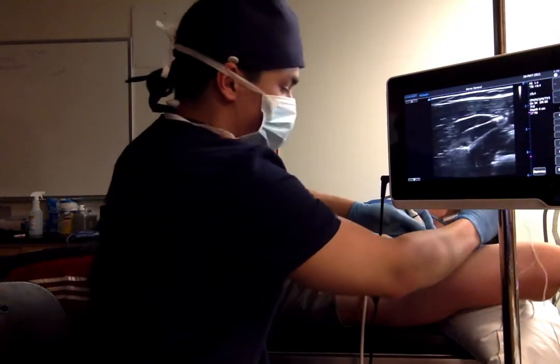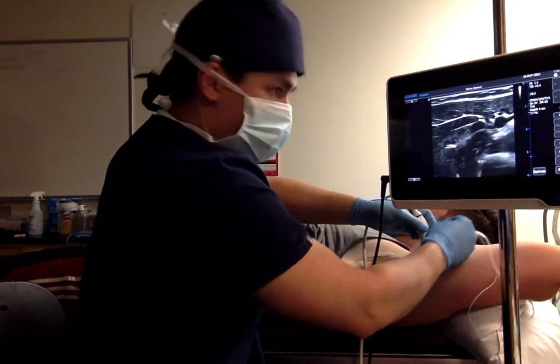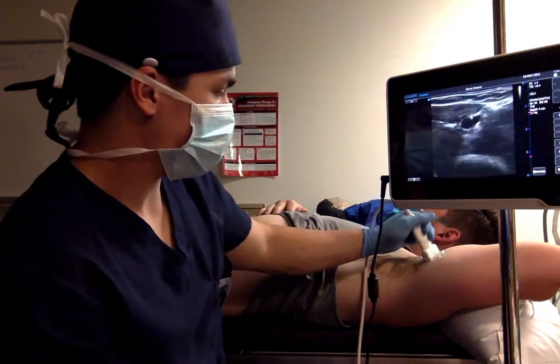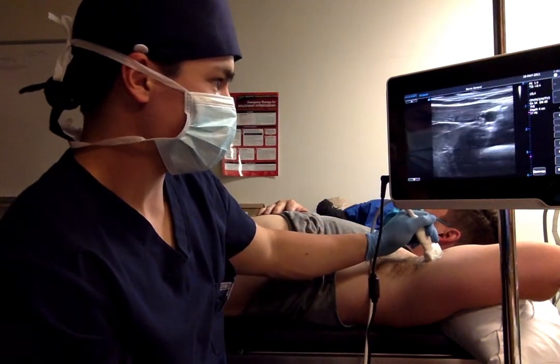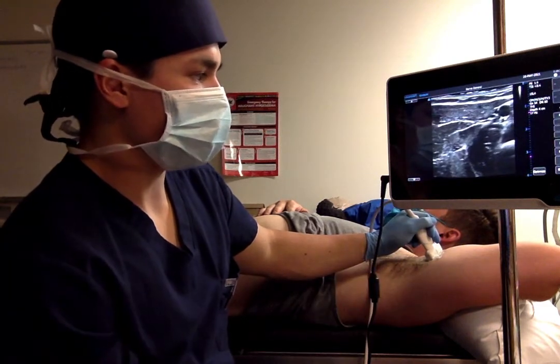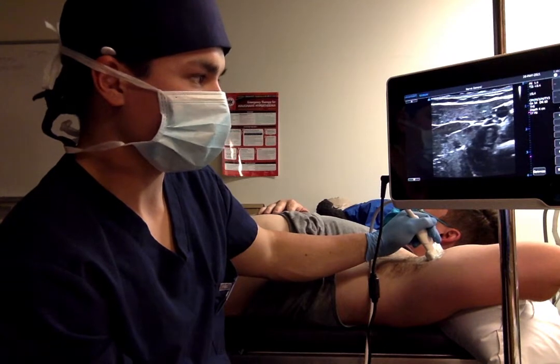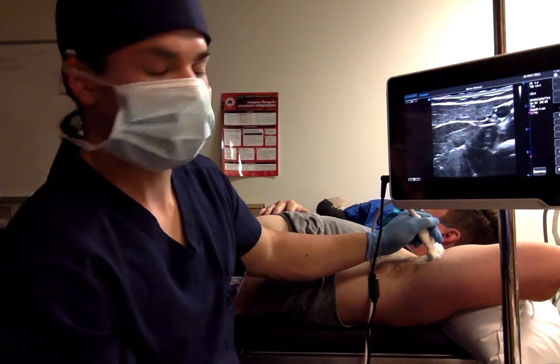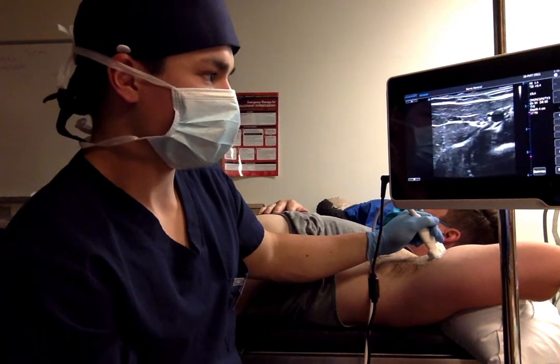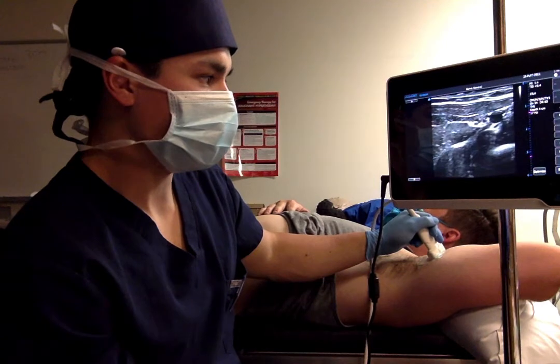And I'm going to approach cephalad to caudad. And we can use the nerve stimulator, starting off with the musculocutaneous nerve. And that's going to elicit an upper arm twitch. And then we can have our assistant aspirate. With the nerve stimulator, we have a goal of 0.3 to 0.5 milliamps. Then we'll aspirate and then inject our 0.25% ropivacaine.